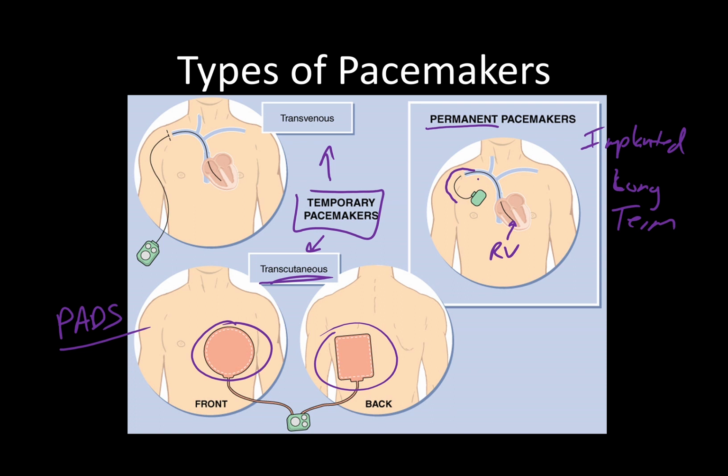The electricity goes through one electrode and comes out the other and runs it through the heart, causing it to contract. They hurt, by the way, so make sure you medicate, because it's like grabbing a hot fence, for those farm kids who may have done that in the past. So keep that in mind with pads. They hurt when we use that to generate a heart rhythm, a heartbeat.